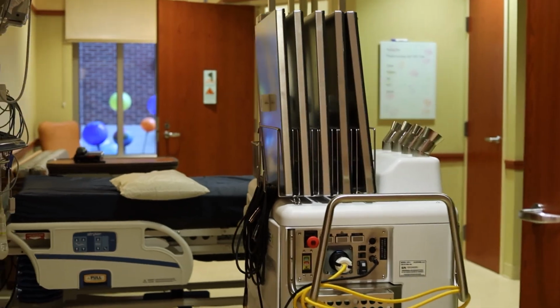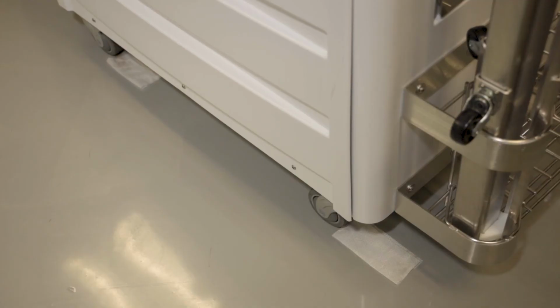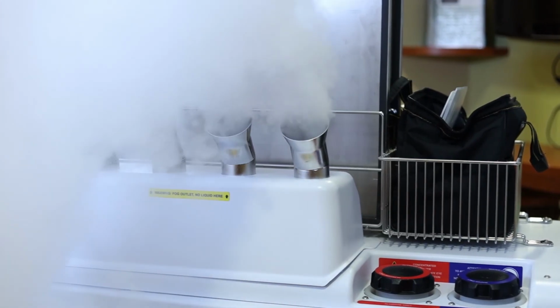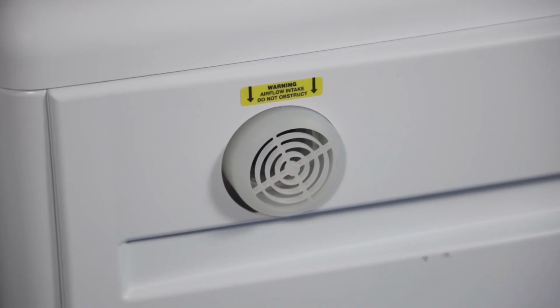Position the machine as close to the center of the room as feasible, and, if possible, direct the fog outlets towards the bathroom with the bathroom door open. To ensure treatment of unexposed contact surfaces, place a hospital disinfectant wipe effective against Clostridium difficile spores under each point of contact. Allow about 3 feet in front of the machine where the aerosol comes out, and make sure nothing is close to the air intake, including curtains and bed sheets.